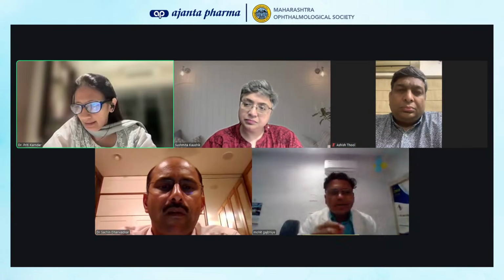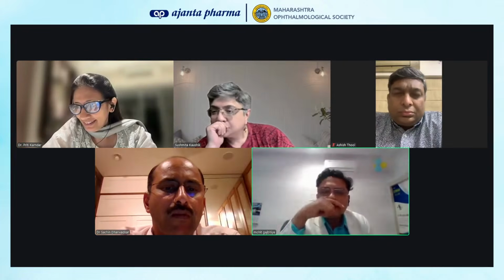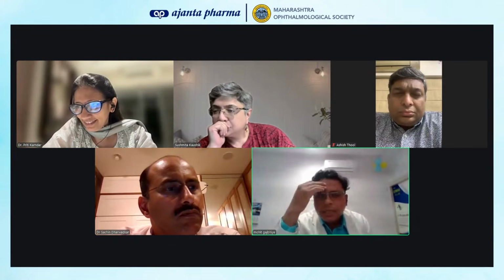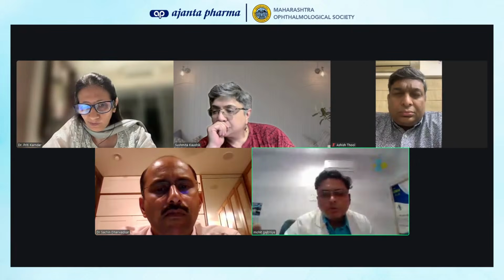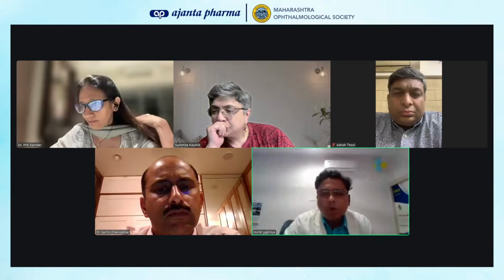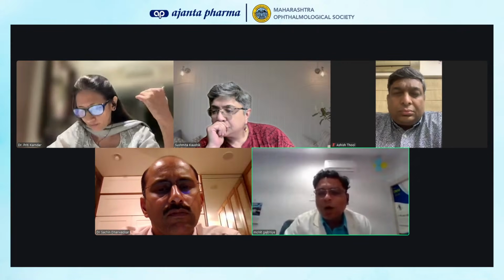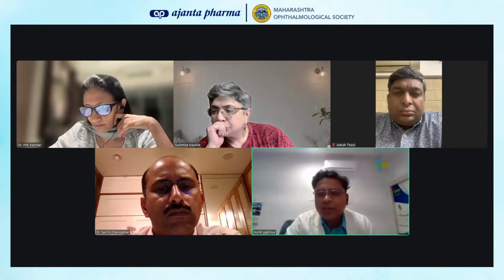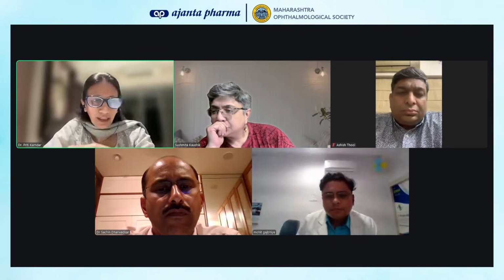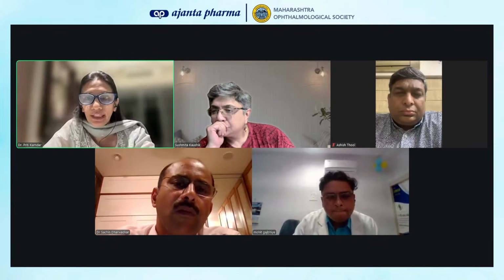Okay, let me take it. Sure. Well, I just want to ask, rather than that 2 standard deviation change, let's say in between the two tests, how much change in microns, like for Zeiss, is it 14 micron, 16 micron? How much change in microns do you think is significant enough? Great question. Yeah, so that is one of the questions. So how much would you say is progression? How would you say noise?